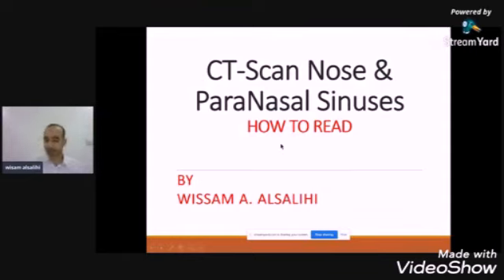Bismillah ar-Rahman ar-Rahim. Now I'm starting our lecture today: how to read CT scan of the nose and paranasal sinuses.